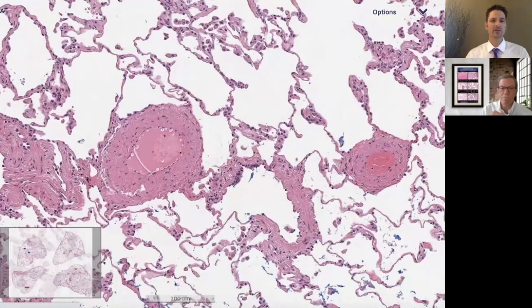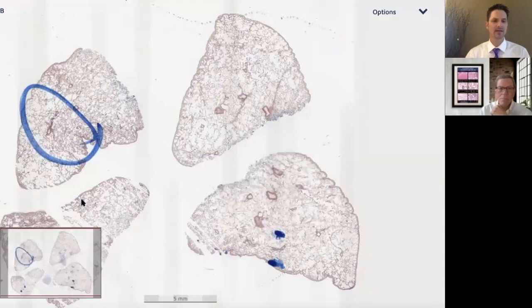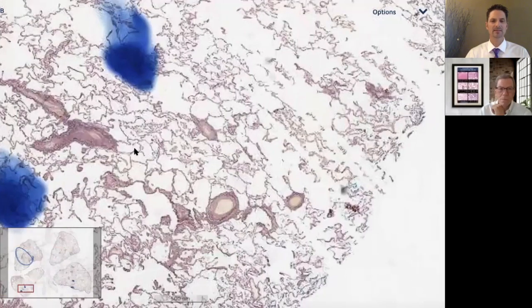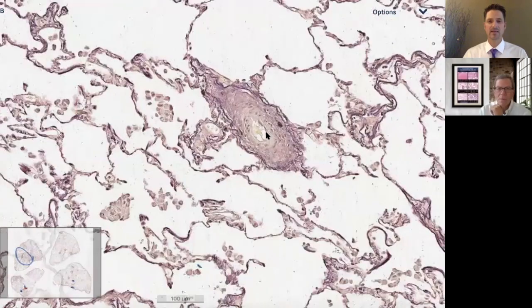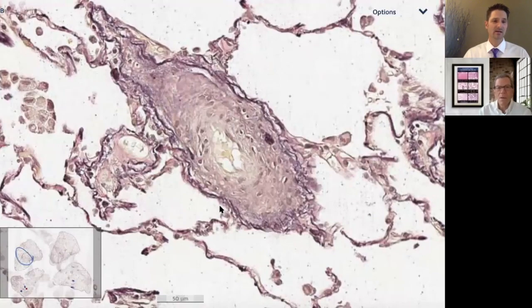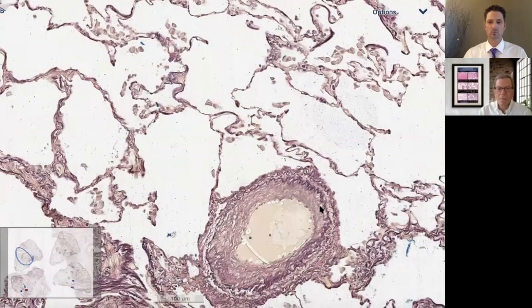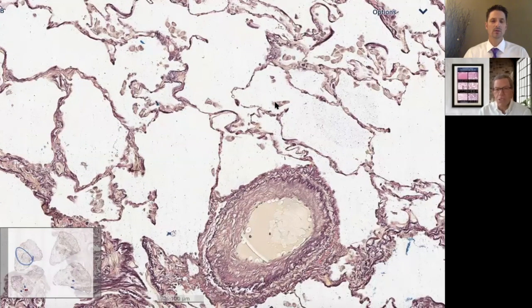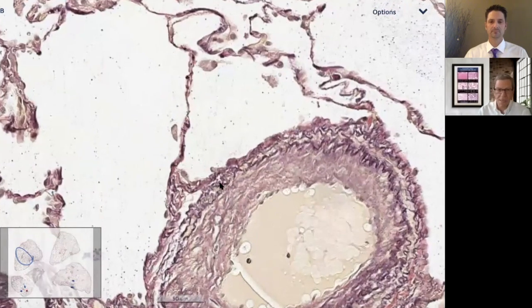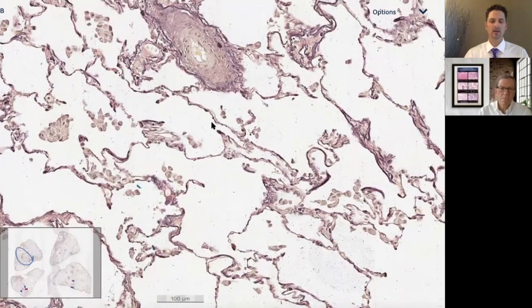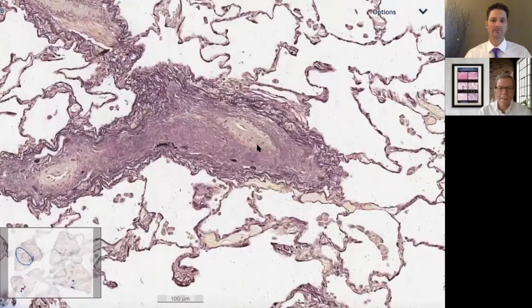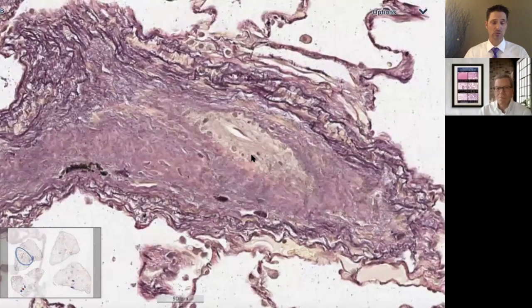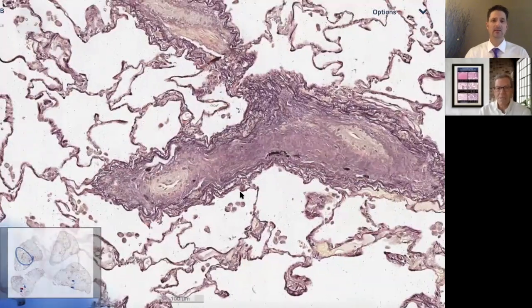We've got a disconnect here. We can jump to this elastic tissue stain which helps distinguish pulmonary arteries from pulmonary veins. Here is that structure we were just looking at — a single elastic layer — this is clearly a pulmonary vein, versus the dual elastic layer here within a pulmonary artery. This shows us that artery is not entirely normal — it has a little bit of eccentric sub-endothelial thickening. So we have mild arterial abnormality but dramatic post-capillary venular abnormality.